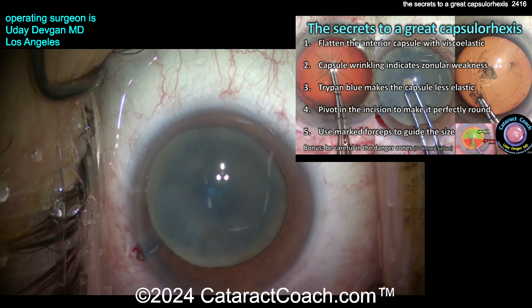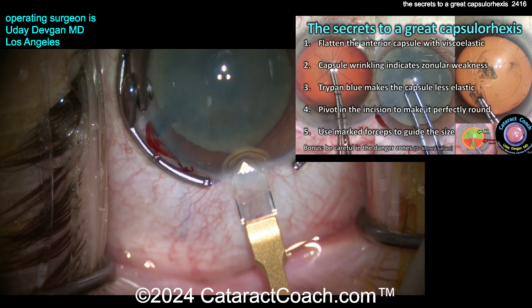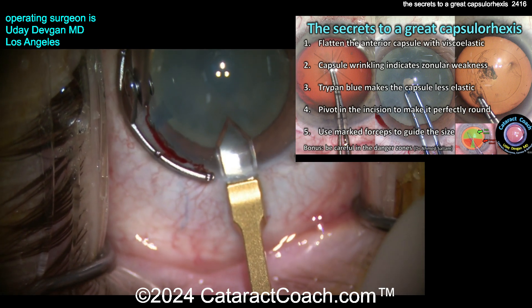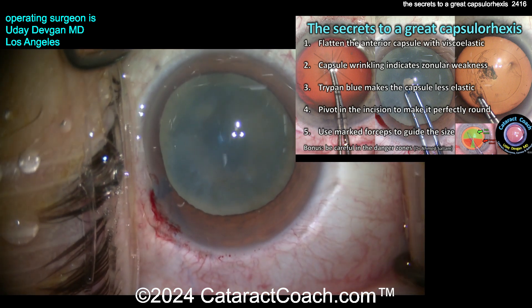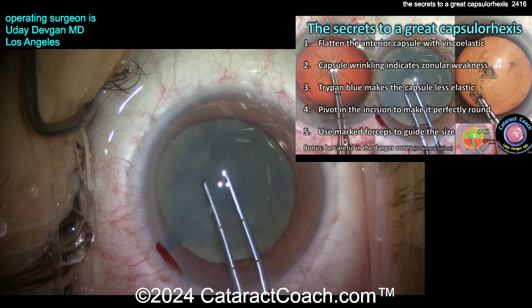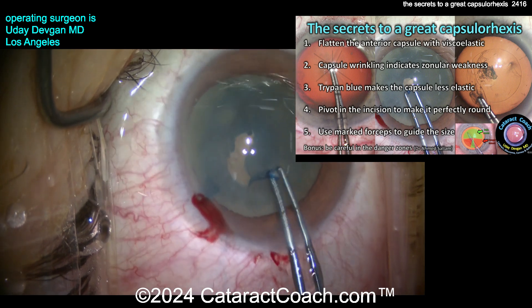Again, beautiful rhexis — looks great. Here's a trypan blue dye case. Viscoelastic in, you can see the blue dye staining the anterior lens capsule. Here comes the diamond keratome to make the incision — entering the AC nice and easy. Look at that single-plane diamond incision, beautifully done. But here's where you'll notice: the trypan blue dye definitely makes the capsule less elastic. That's a two millimeter wide keratome, so I slightly enlarge the incision to 2.2 to 2.4 millimeters wide. Watch as I go on the capsule with the forceps — good zonular support, but the capsule just kind of falls apart a little bit. It's more friable, less elastic — you've got to be a little more careful here.